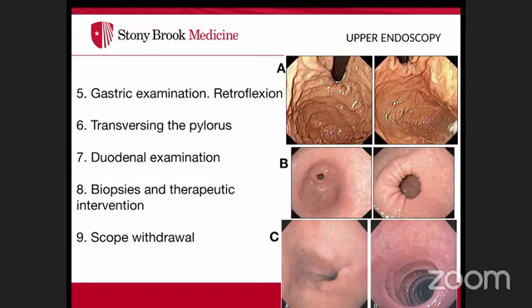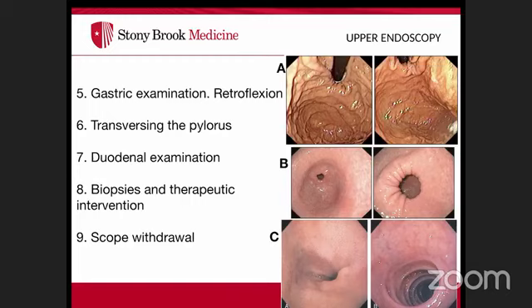To intubate the second portion of the duodenum — arguably the second hardest part — advance through the loop, pull back the large wheel, push the small wheel all the way forward, and rotate the scope to the right while angling slightly downward. As one mentor described it, 'like dancing with the scope.' This maneuver guides the tip into the duodenal lumen.